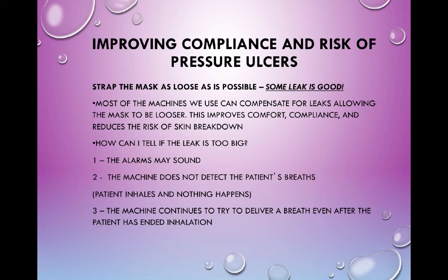Now there is one circumstance where you may see a patient take a breath and nothing happens, and it's not related to this. So going back to, we had talked about obstructive sleep apnea patients, and I said we've only identified about half the patients who have obstructive sleep apnea. The reason that's important is we'll have patients who come in, and let's say normally if we actually diagnose that patient, or even some of them have been diagnosed, and they wear 12 of CPAP at home.